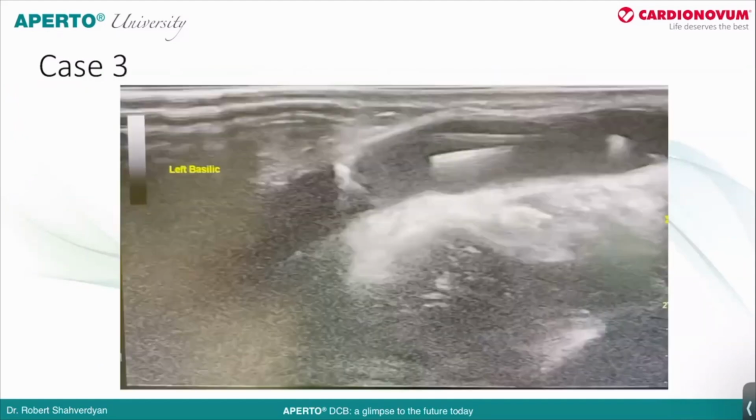I think the example of the AV grafts is really interesting. Again, like I mentioned before, the stent grafts seem to take over as primary, even in most cases, primary treatment of graft venous anastomosis stenosis by endovascular means. And this, of course, is a small group, short experience, but it can also show that an angioplasty can be effective in treating graft venous anastomosis stenosis.